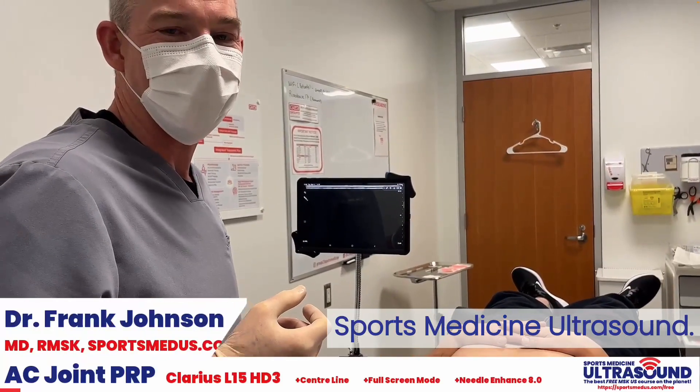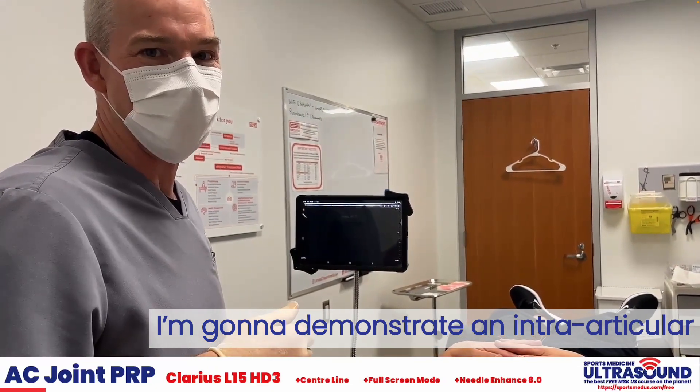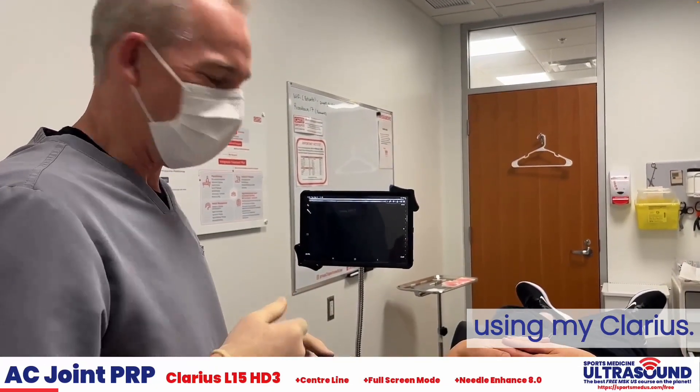Hi, Dr. Frank Johnson from Sports Medicine Ultrasound. I'm going to demonstrate an intra-articular AC joint PRP injection using my Clarius.